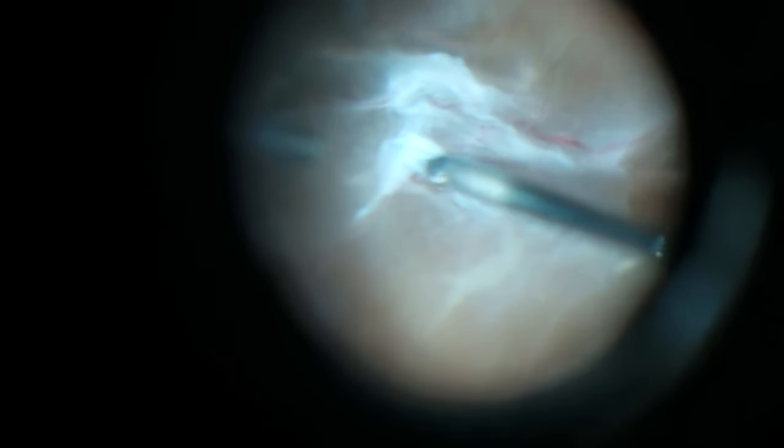I use the scissors both to cut free the stalks that are attaching the scar tissue to the retina, and also to dissect the scar tissue away from the retina to create a plane that allows for the scar tissue to be cut free either with the scissors or with the vitrectomy cutter.